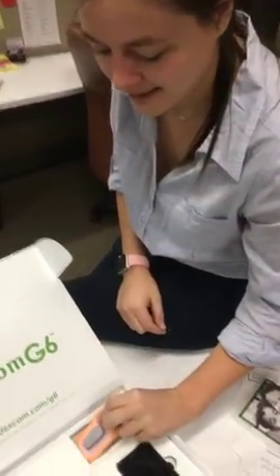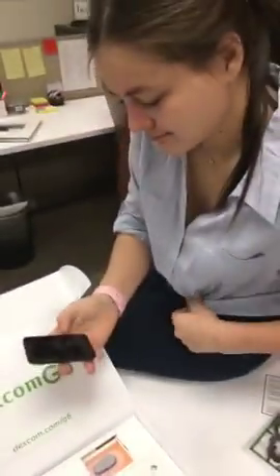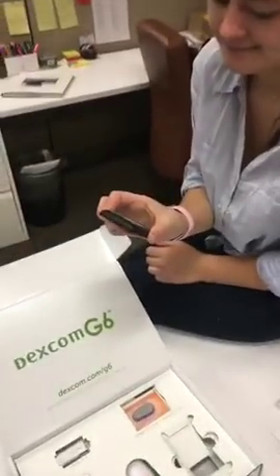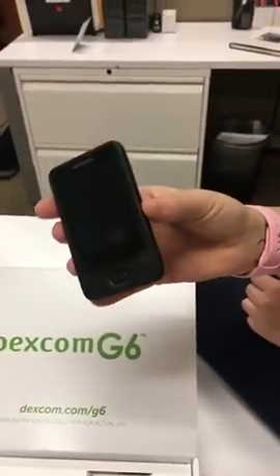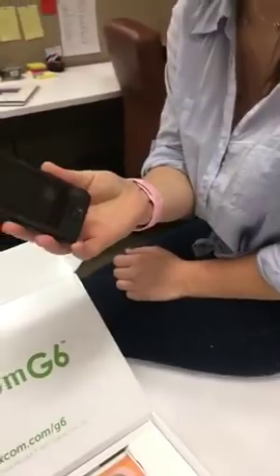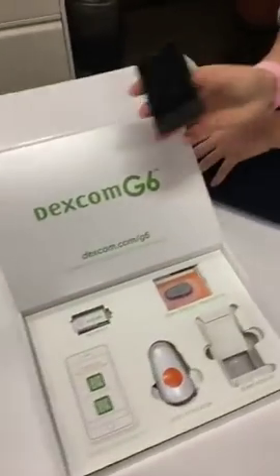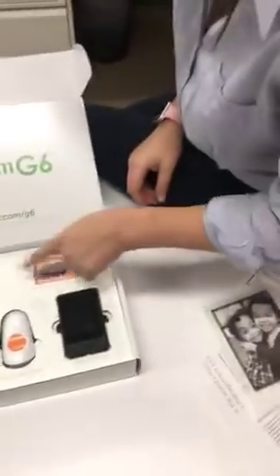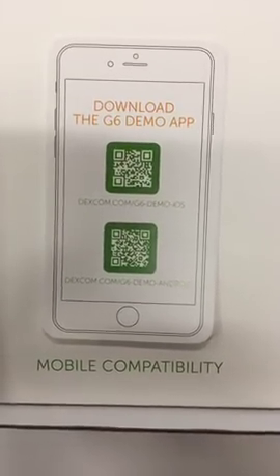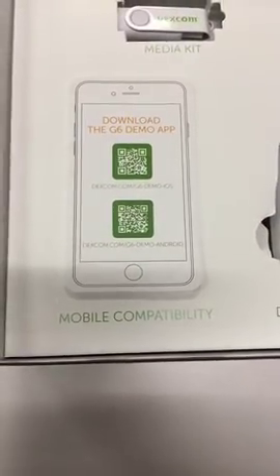We have a question from Jordan asking if the receiver is the same as the G5 Touch. We both just use our iPhones, but this is what the receiver looks like — it looks very similar to the G5 receiver. I would assume they probably made this to work with both the G5 and the G6. This will also connect directly to a smartphone — it works with both Android and Apple devices, including iPhones, Apple Watches, and Android watches.